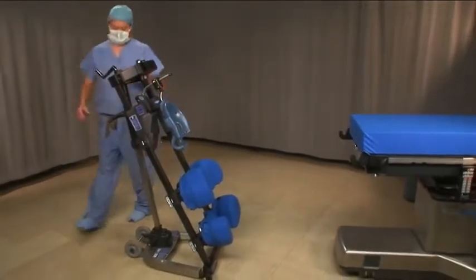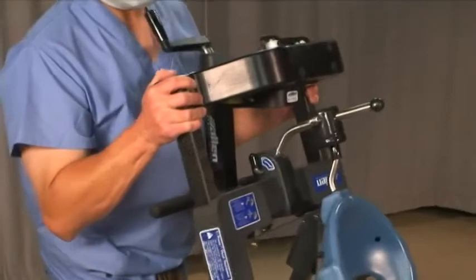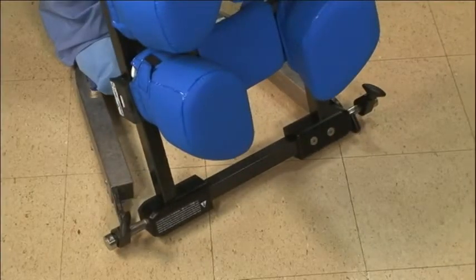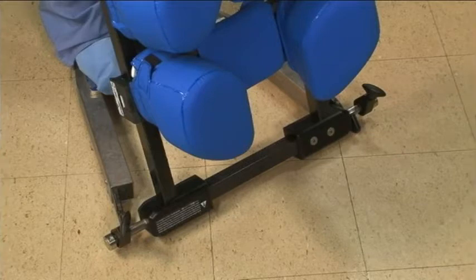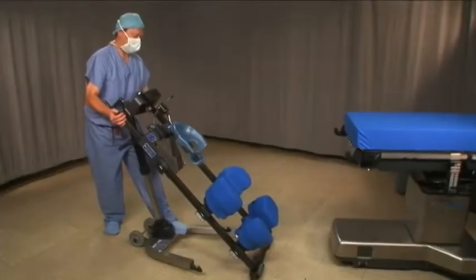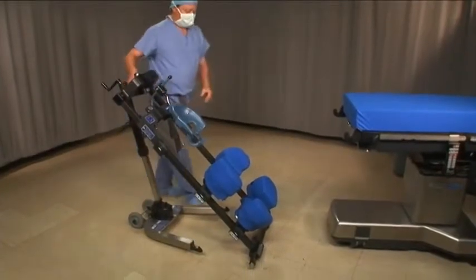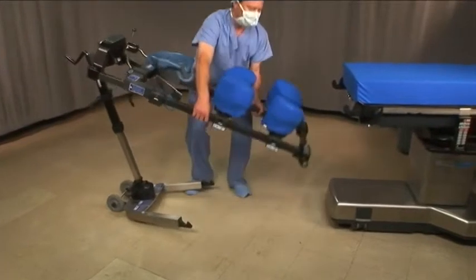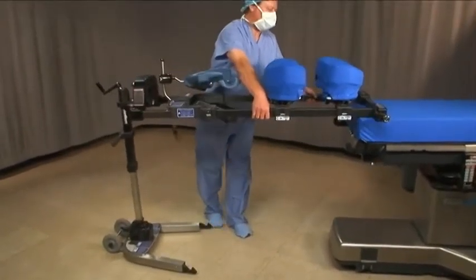Stand behind the frame and put one foot on the base. Place your palms against the top of the frame and press forward on one side to walk the pin out of the hook. Now press on the opposite side to remove the second pin. Slowly lower the frame down and let it slide along the floor. Keeping your back straight, bend your knees and lift the frame up. Rest it on the end of the table.